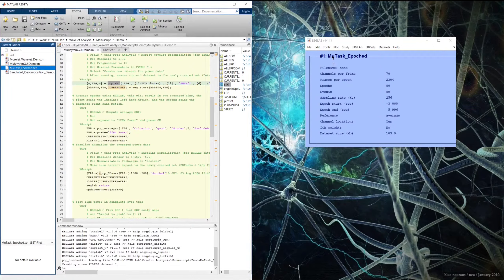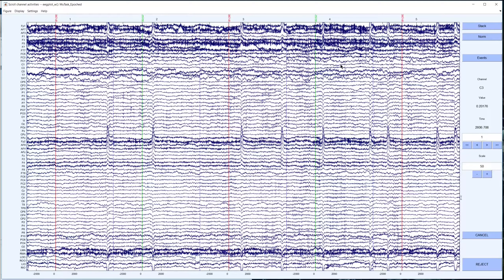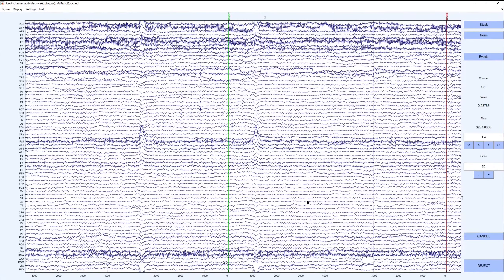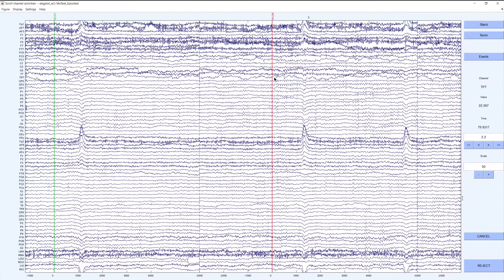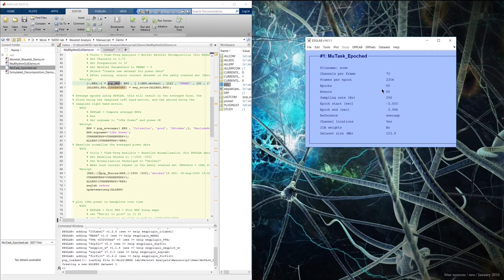This EEGLAB dataset has already had some basic preprocessing steps applied to it, including common average re-referencing, a frequency filter from 0.1 to 50 Hz, and data epoching relative to the left and right arrow events. You can see this data here — 9 second long epochs with the event occurring 3 seconds in. Bin 1 events are the trigger for the left-hand imagined motor movement, and Bin 2 events are for the right-hand imagined motor movement. There are 80 total epochs: 40 left-hand and 40 right-hand imagined motor movements.